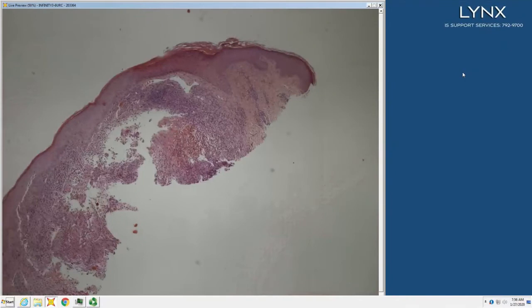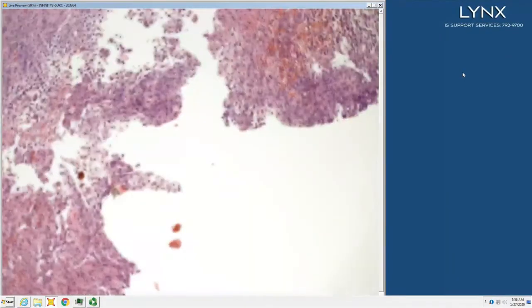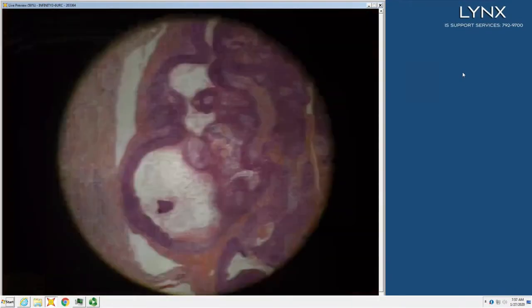I see edema and inflammation. Looks like granulomatous and suppurative. Yeah, so suppurative and granulomatous, and it's kind of central. So what would be a central structure around which a suppurative and granulomatous process would occur in skin? Usually follicle, as you said. So suppurative and granulomatous folliculitis, often infectious, sometimes acne. Well done.